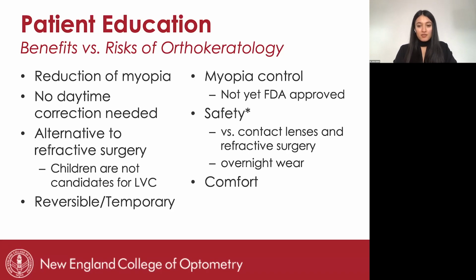Comfort is less comfortable than soft contact lenses, as I mentioned earlier. I usually describe it to my patients as an eyelash in the eye. The very first time we put the lens on the eye, we do use a topical anesthetic so that the initial comfort isn't an issue, and there's a gradual period to the discomfort, if you will. And then since the eye is closed, the comfort tends to be less of an issue as the patient wears the lenses with the eyes closed, and they're sleeping for a majority of the time they have the lens on.